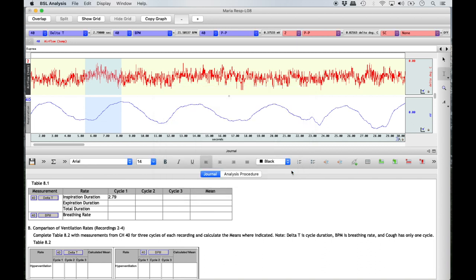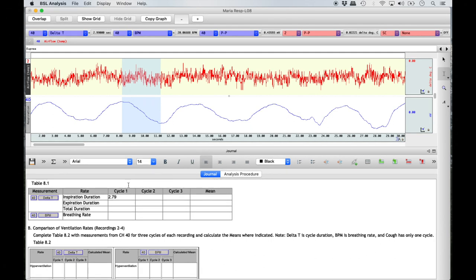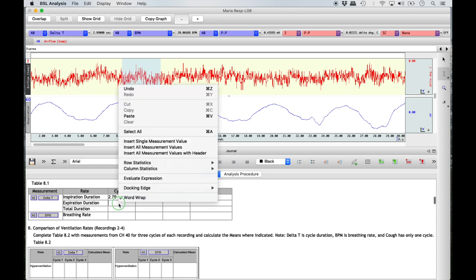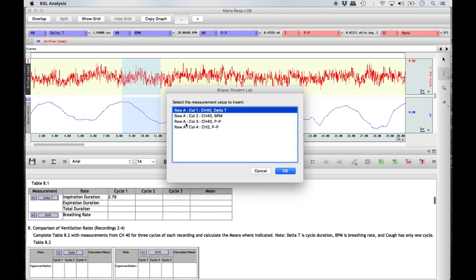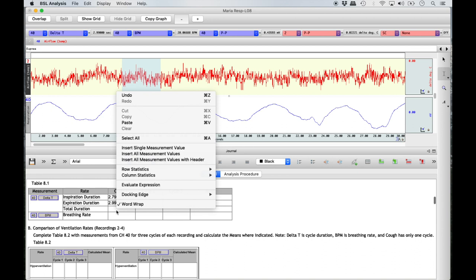Now highlight the area of expiration for the same respiratory cycle by bringing the I-beam tool to the peak of the wave where inspiration ended, hold down the left click, and highlight until the I-beam reaches the next valley or base of the wave. Enter the duration of expiration by right-clicking the appropriate column and row for cycle 1, selecting 'Insert Single Measurement Value,' and then Channel 40 Delta T. To calculate the total duration for cycle 1, right-click in the appropriate column and row, select 'Column Statistics,' and then 'Sum' from the side menu.